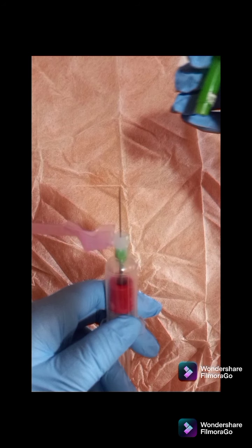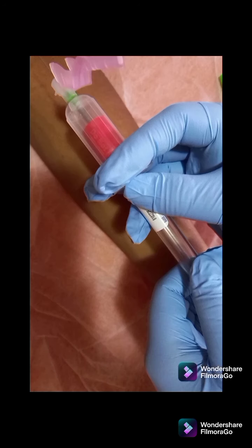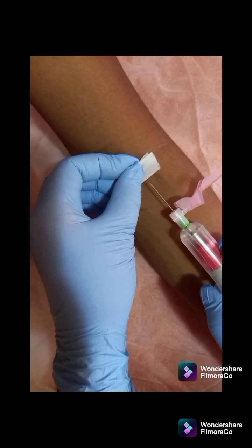Reapply the tourniquet, uncap and inspect the needle for defects. Ask the patient to remake a fist, anchor the vein and insert the needle, bevel up, as stated earlier. Establish blood flow by pushing the tube completely into the needle with your thumb. Blood should flow into the tube until the vacuum is exhausted. Remove the tourniquet and ask the patient to open the fist. Ensure all tubes are filled in order of draw and mix immediately upon removal from the holder.